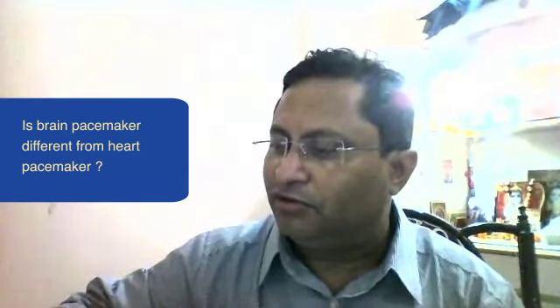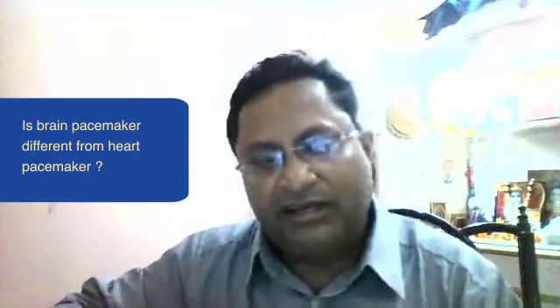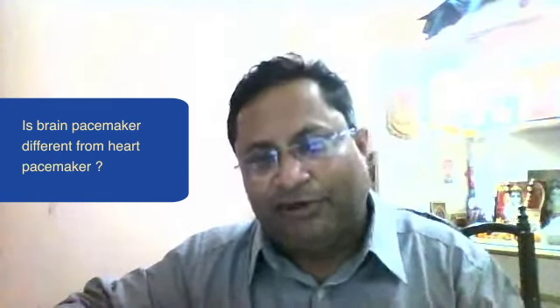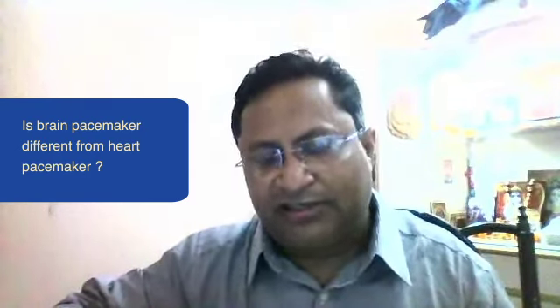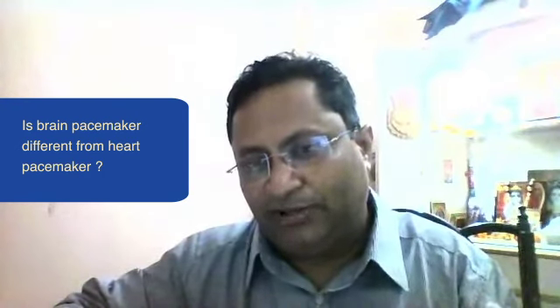One question I can see: even in the heart, pacemakers are installed. Are these the same? Are these specifically for neuro patients? Yeah, pacemakers are for the heart also. A pacemaker is required for conduction disorders, but these are different pacemakers. These are not the same as a heart pacemaker. Heart pacemakers are different, but these are brain pacemakers, which are used only for neurological diseases. These are not heart pacemakers.